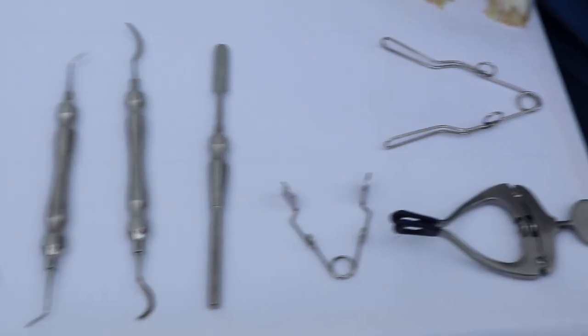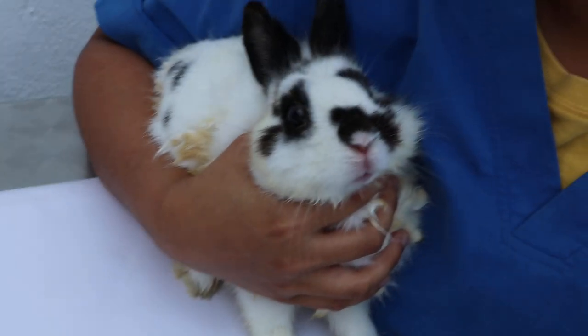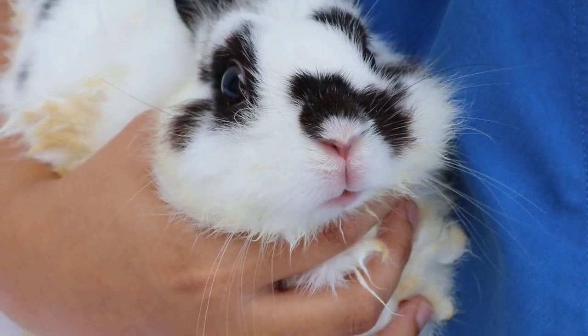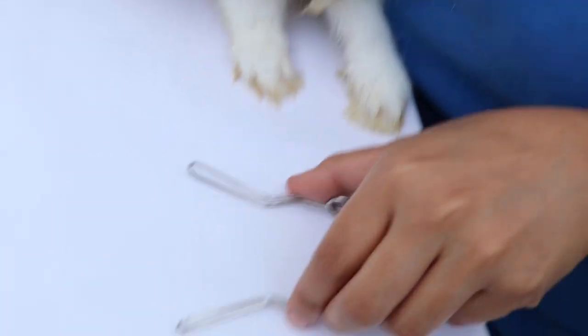Now we will show you how to use the rabbit and rodent dental instrument. This will be just a demonstration of how to use the dental instrument, because the rabbit is not sedated and has no dental problem.